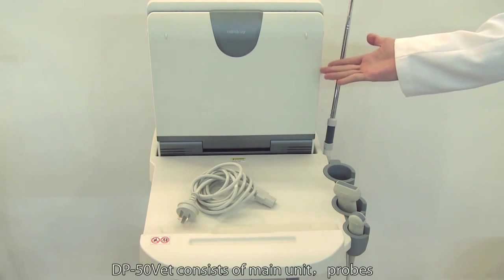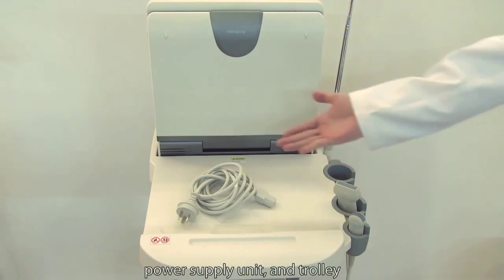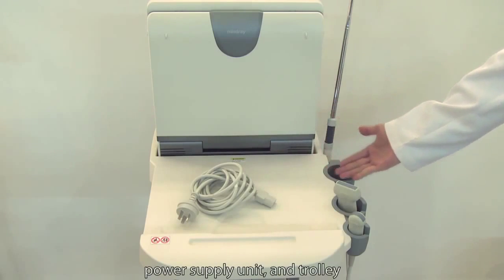DP50VET consists of main unit, probes, power supply unit, and trolley.